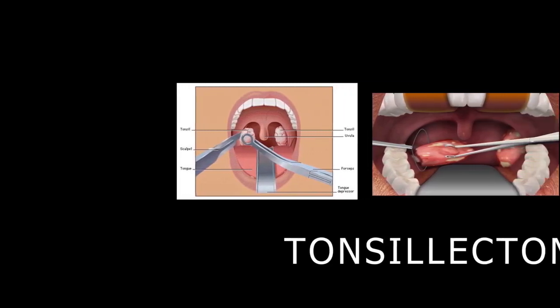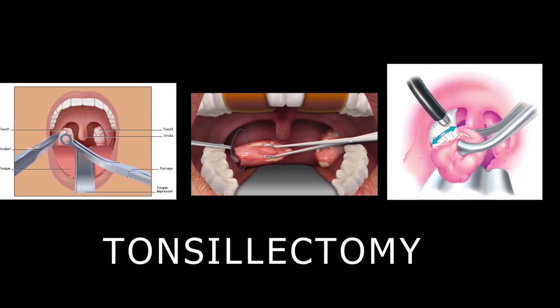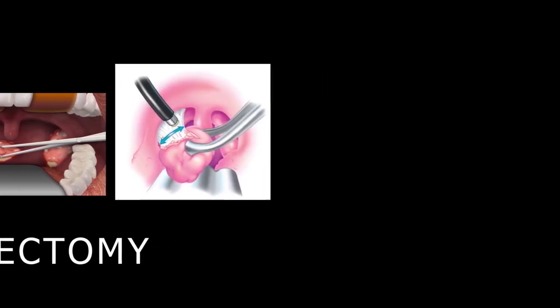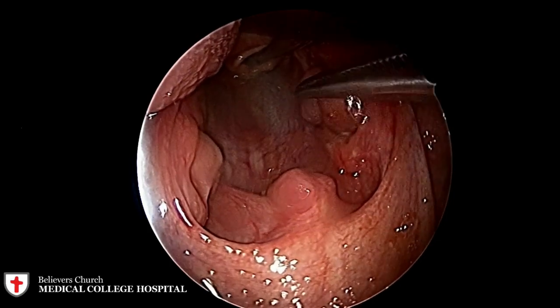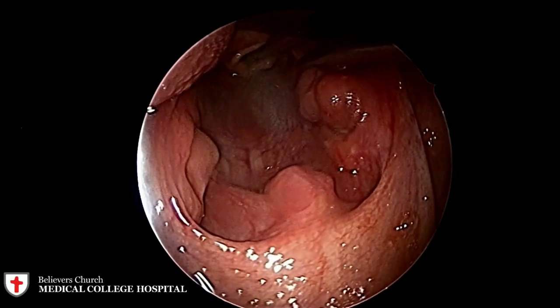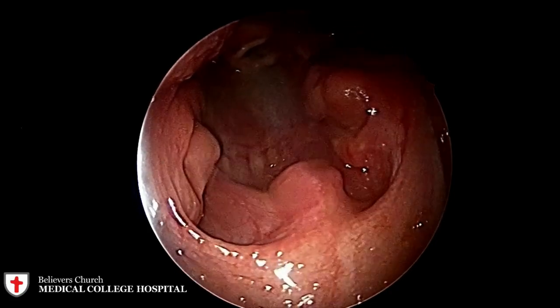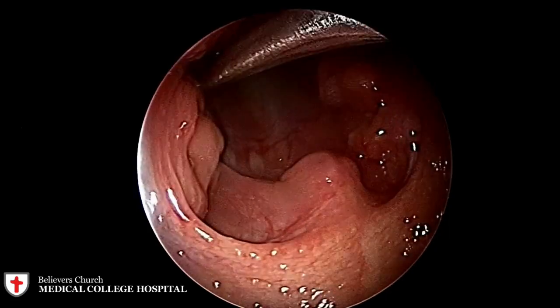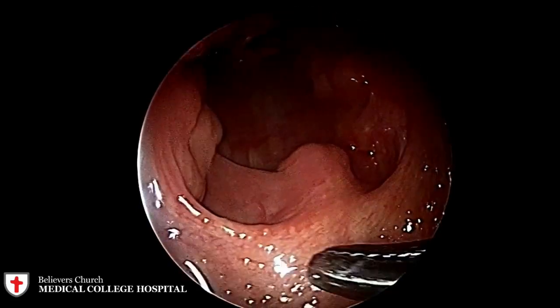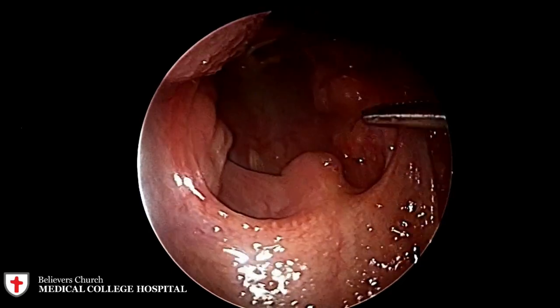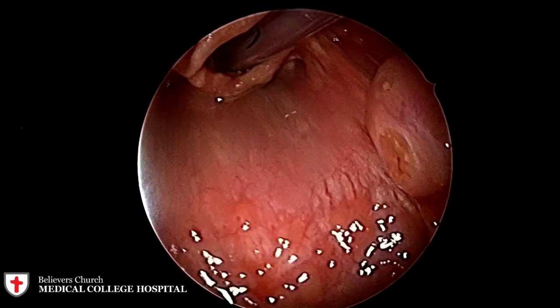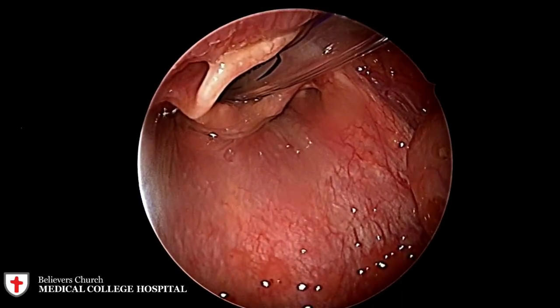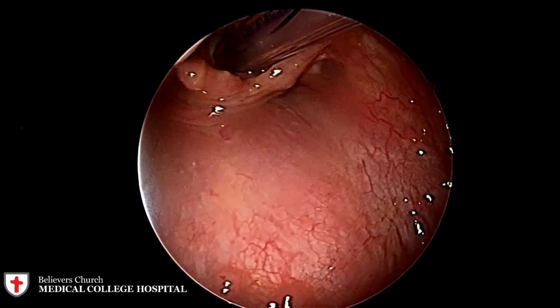Now let's look at the surgery of tonsillectomy. The patient is in Rose's position under general anesthesia. Remember that you are viewing the oropharynx in the inverted position. This is the right tonsil being touched by the instrument, and this is the left tonsil. The uvula is in the center and is identified for reference. We are also looking at the larynx with the endotracheal tube inside.